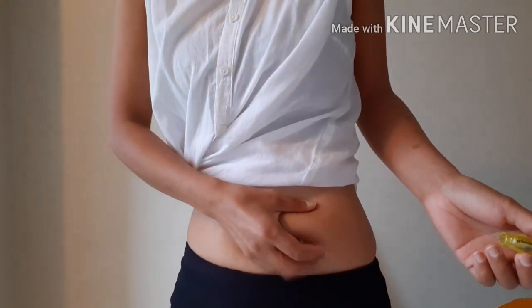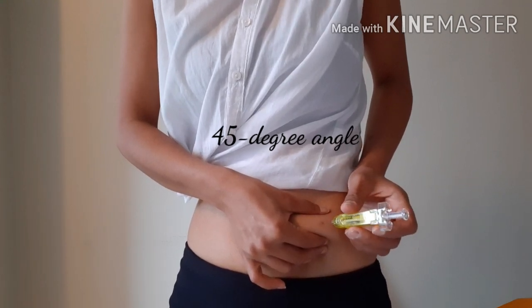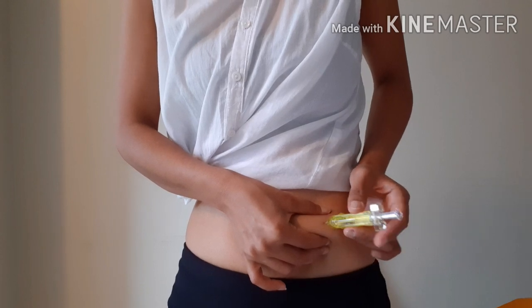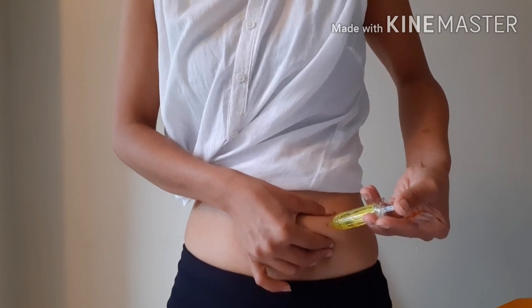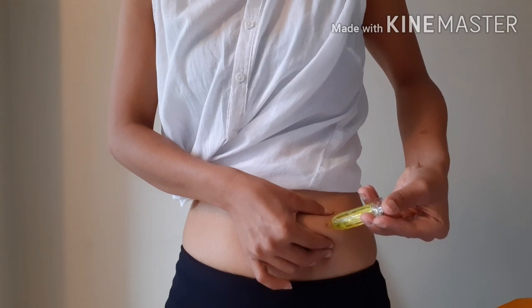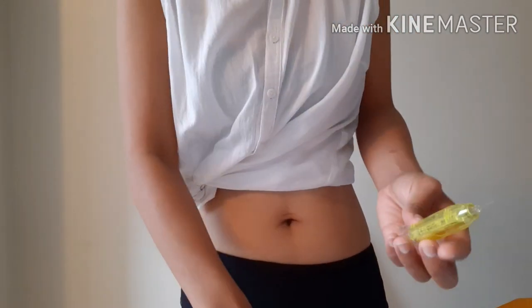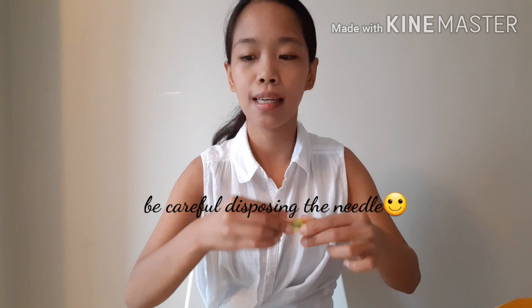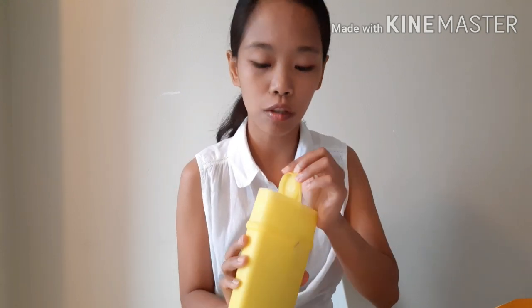Measure one, two inches, then pinch the skin — there isn't much fat but you do your best. Then slowly inject. You can slowly feel the medication going in. Done! Now we put the used needle into the sharps disposal box. When it's full I bring it to my doctor, they dispose of it properly and give me a new one.